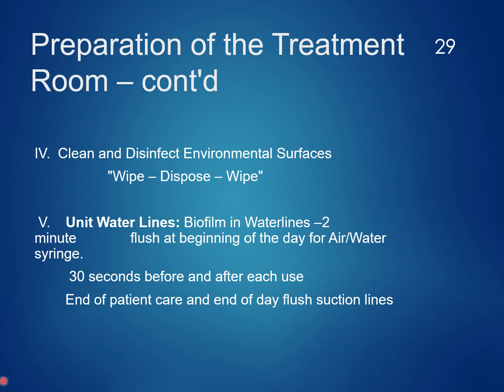Our unit water lines: biofilm or bacteria builds up in these water lines. At the beginning of the day, we're always going to flush our water lines for two minutes with that air-water syringe.